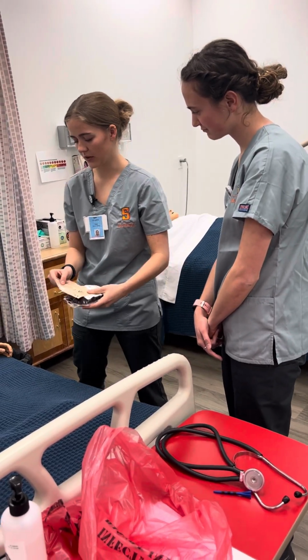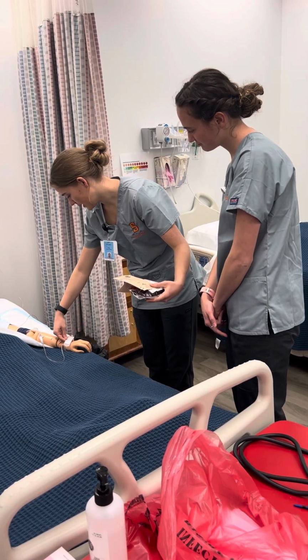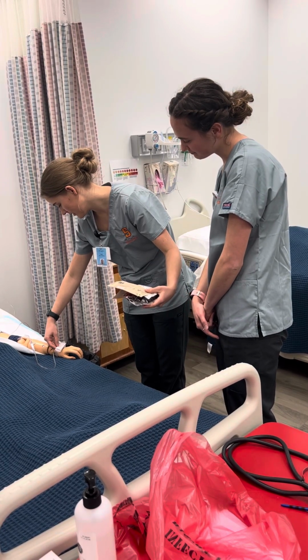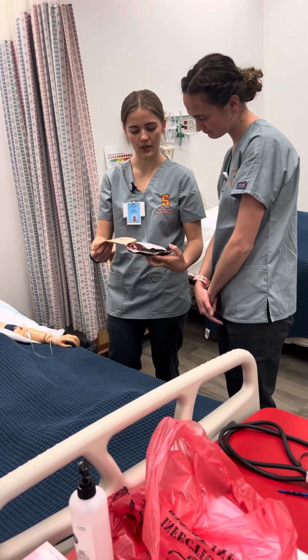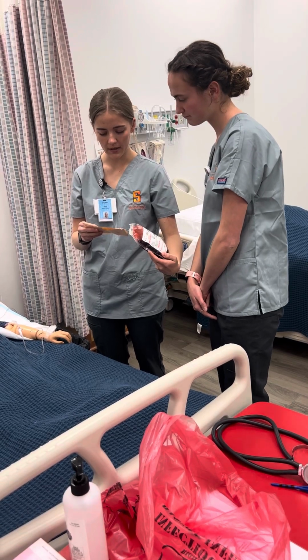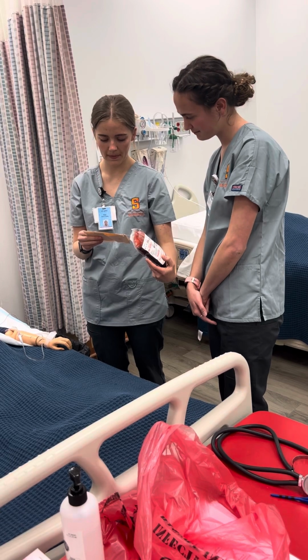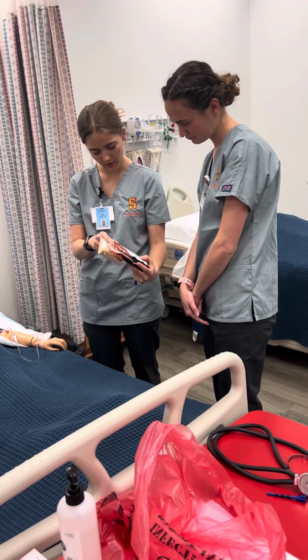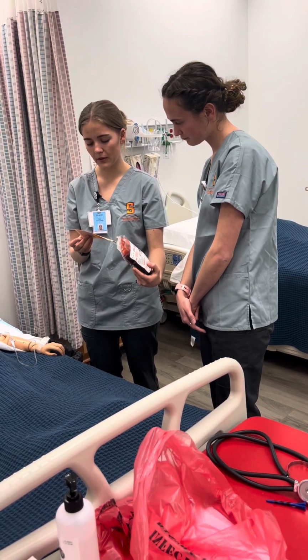So I'm gonna just make sure that we've got our Darius Hansen. Yep, Darius Hansen. Date of birth is 8/10 and year. 8/10. And then I'm gonna go ahead and double check with the blood on this. I've got, he is A positive, and this blood is O negative. Yep. Perfect. And I'm gonna double check the expiration date with here. So expires 1/3/23. Perfect.